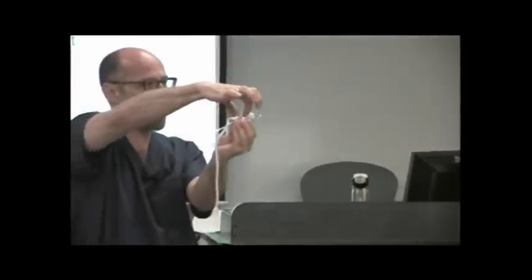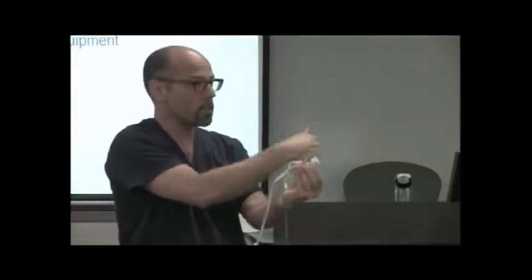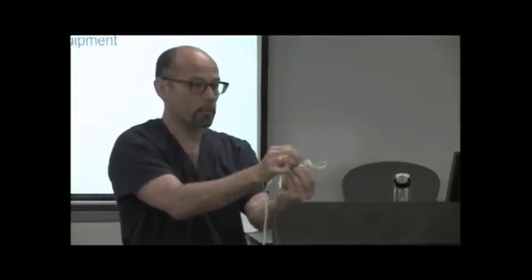They all look the same. I don't care what company they come from. They're all very similar. The other thing that it has on it is this little pigtail. Some of them have a squeeze valve on them. It's called a rapid flush device. So when I pull on this or squeeze it, it forces fluid through that line very quickly to flush the line. That's what that is. So just kind of take a look at it.